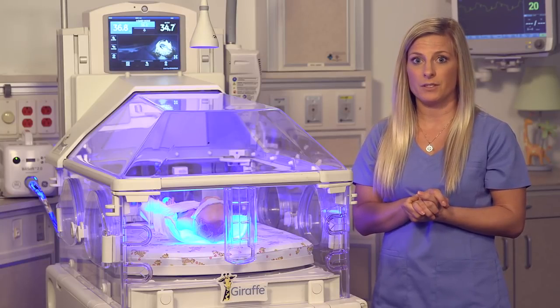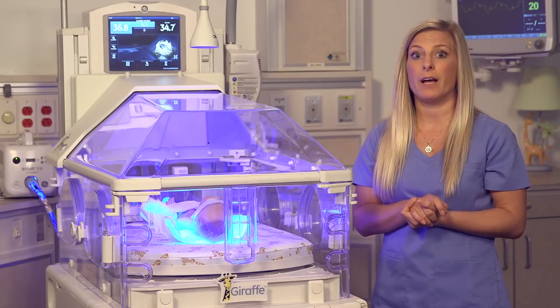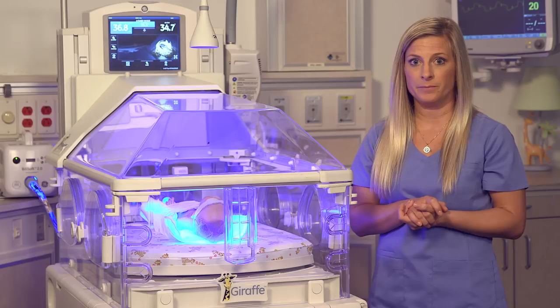Inaccurate readings may result. You'll need to install new batteries if the display window is blank or a battery mark will appear above the measured value. If you continue to use the instrument, the mark will start to blink and measurement will no longer be possible.